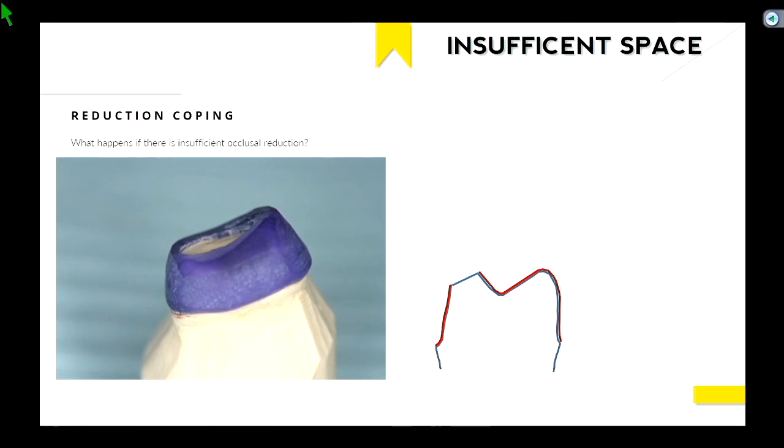Okay, but let's say that sharp edge bothers you just because visually you don't like a sharp edge. What's the problem with rounding that out clinically? What if you took a little slow speed disc and just rounded it out? You'll just have a small gap there, right? So the principle is, as long as you reduce more on the tooth than what your lab technician did, your crown should still seat, right? So yes, if you round it out just because it makes you feel better, go ahead. If it's just a minimal amount, you're generally not going to alter your retention resistance form.